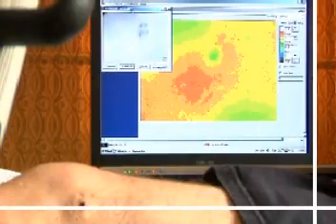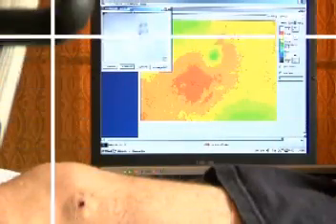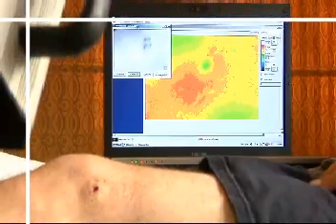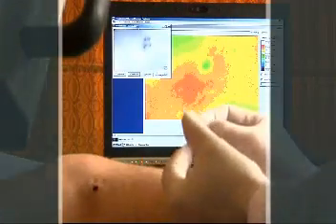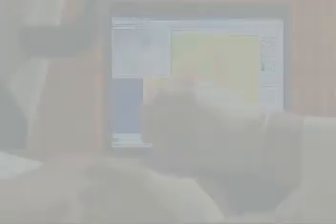Next thing we'll do is turn on the radio ablation unit. And then we're going to insert the probe. You feel that? Just pressure? A little bit.